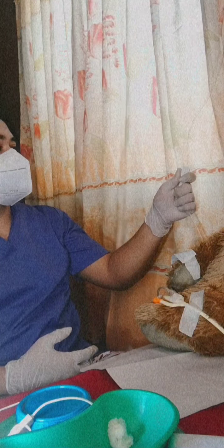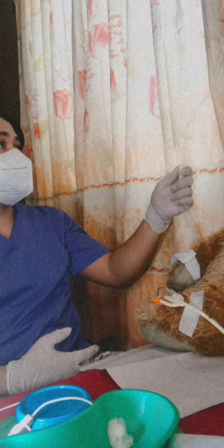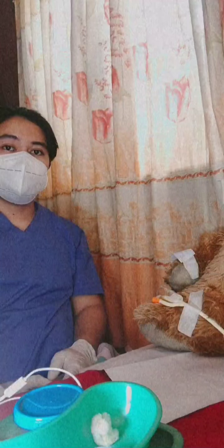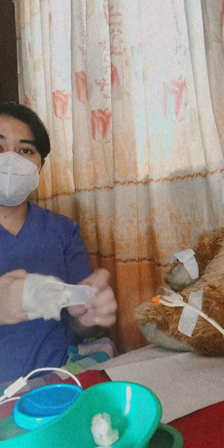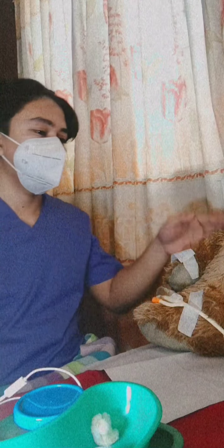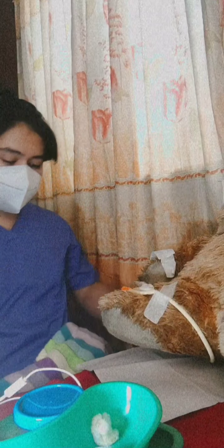Next, we need to check the clamp if it is on, and then regulate the flow of the irrigation tube according to the ordered flow of the physician. Next, remove gloves, and then position the patient in a comfortable position, and then cover him with bed linens.